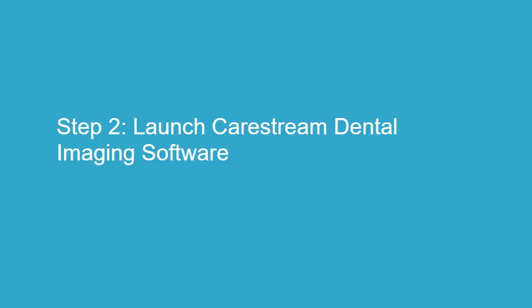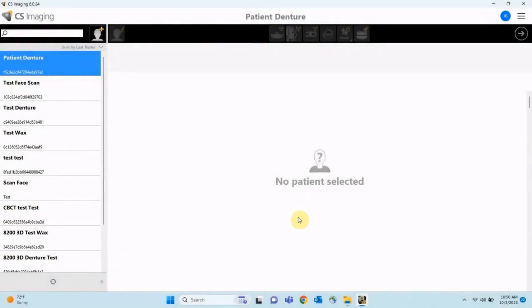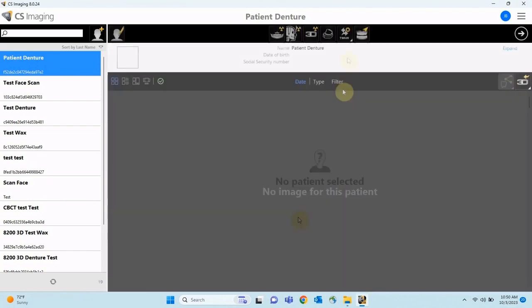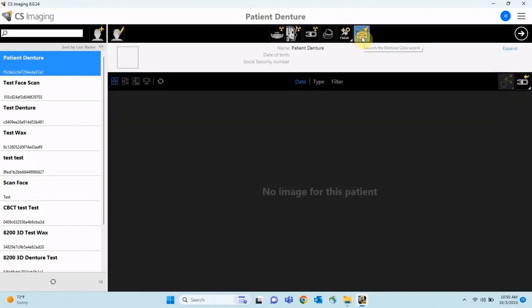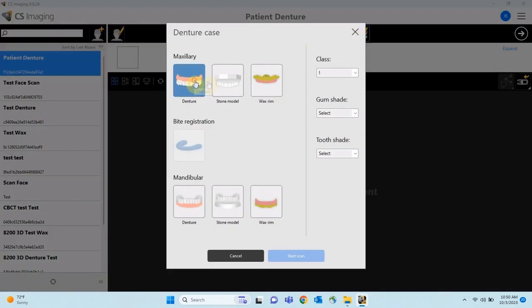Step 2: Launch CareStream Dental Imaging Software. Next, we will initiate the scanning software. Open the patient card and launch CS Imaging from your DPMS or as a standalone application. Verify the account is logged in, then click the digital denture icon from the acquisition menu.